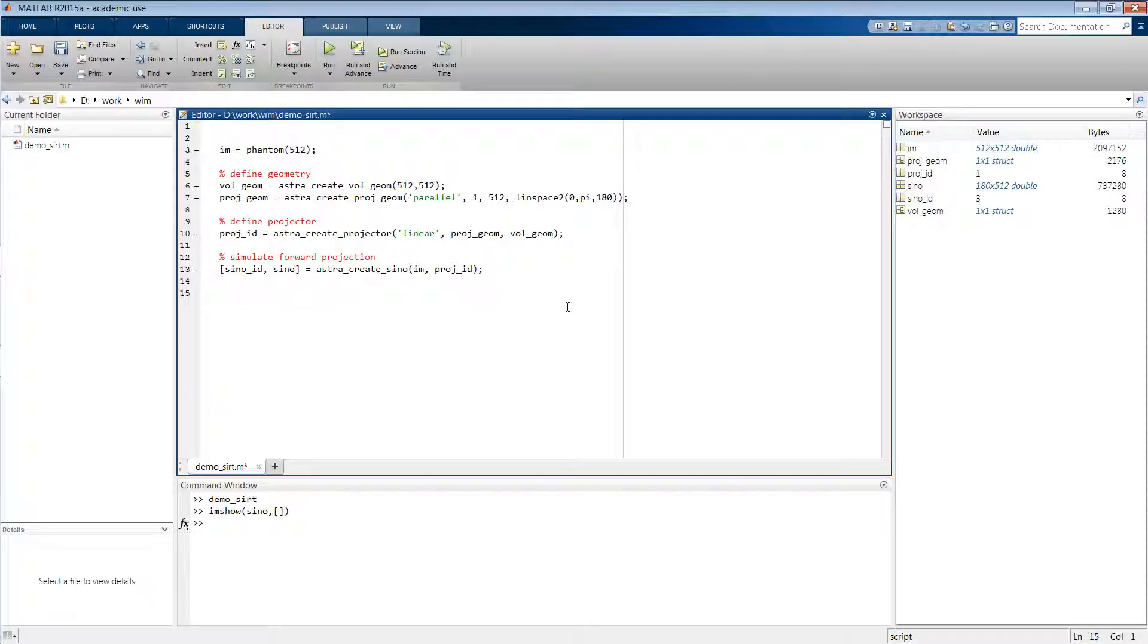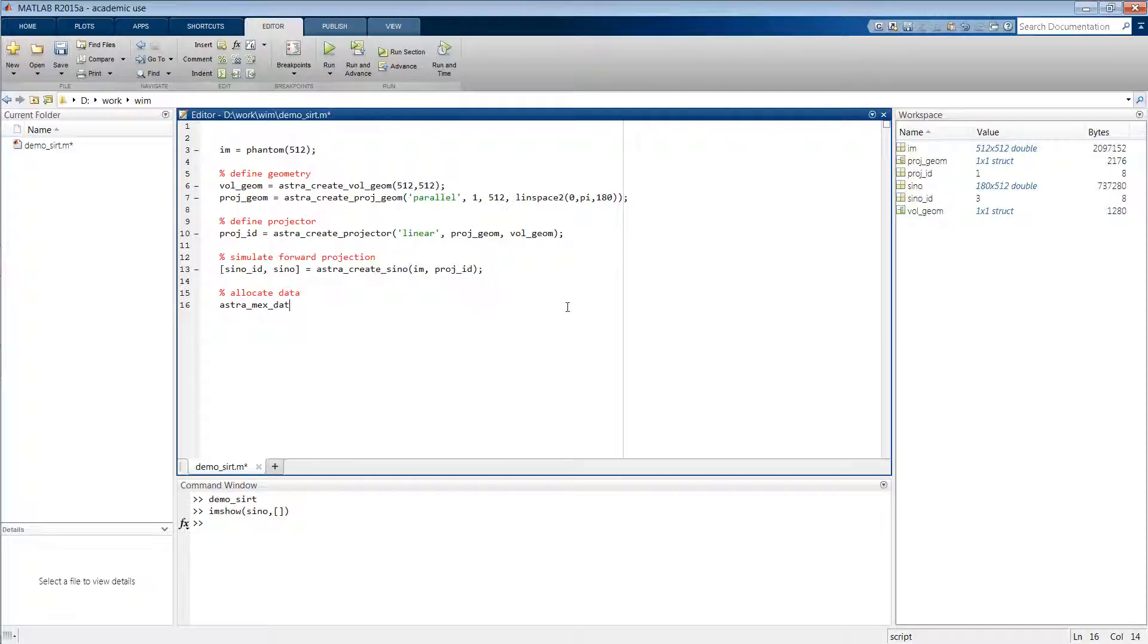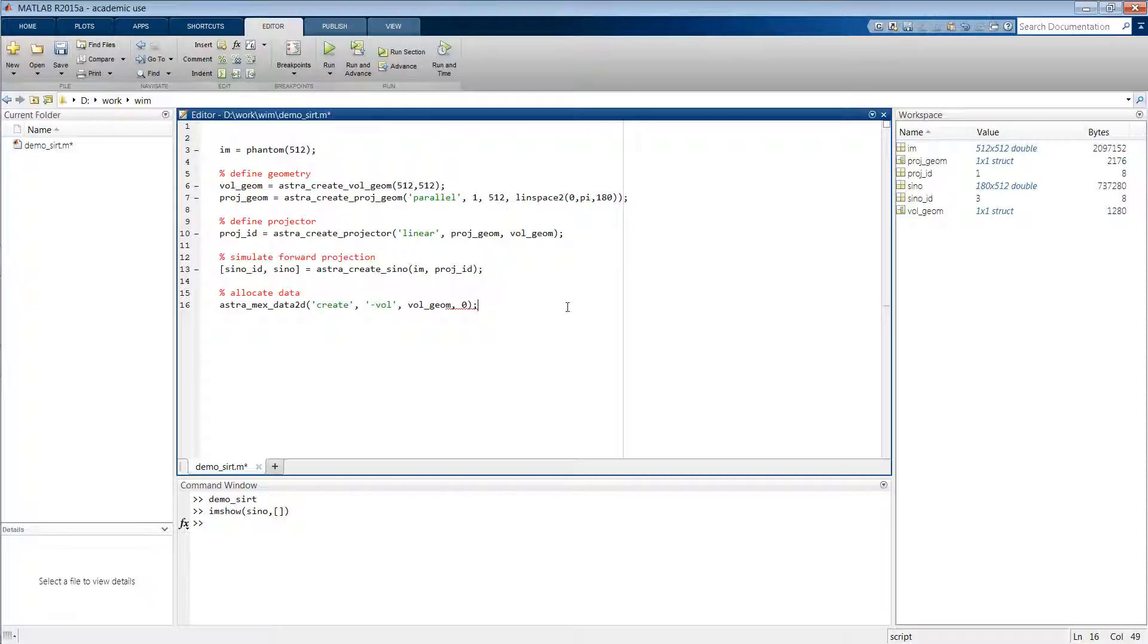Now before we can reconstruct this sinogram, we first have to allocate some data in which we will store the reconstructed volume. We do this by typing astra_mex_data2d('create'). We want this to be a volume object linked to our volume geometry, and we want to initialize it with zeros.